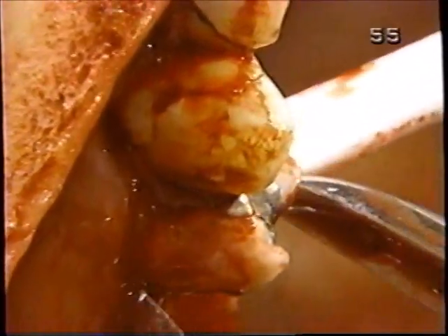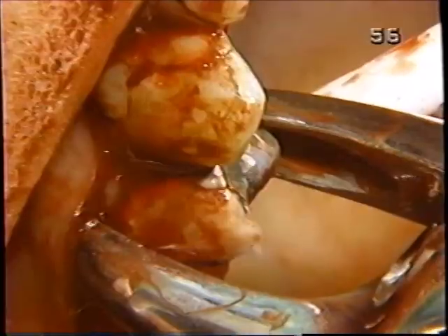Okay. These are only coming out this way because of the previous luxation. This one has generally 2 roots, and it's common to break one of those roots, but it's been luxated, and our force will be more to the facial than the lingual, so that if one of these roots does break, it would be the facial one, which is easier to retrieve and not as close to the sinus.